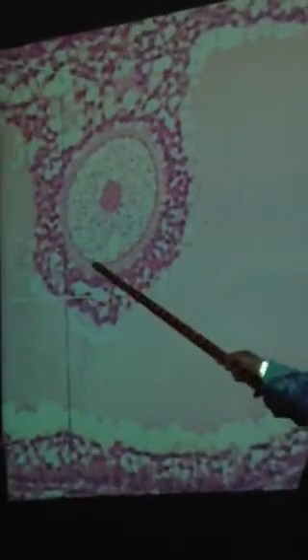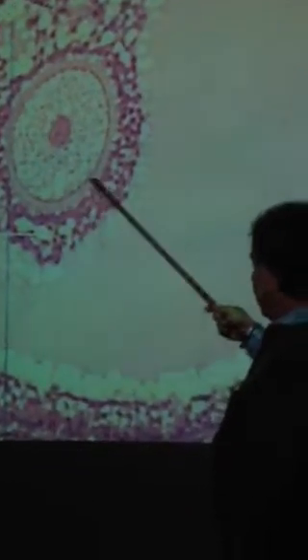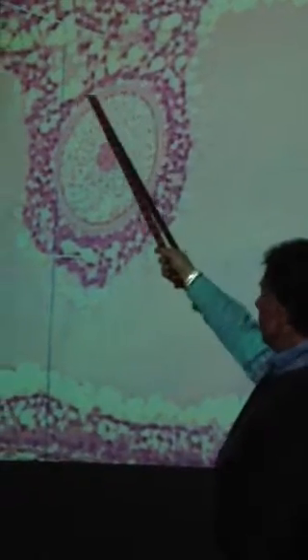All right, what are we looking at here? This is a follicle. It's got a large antrum. See the antrum, right? It's got the ovum, and then what's this area around it called? Anybody, real quick. Got to go through this quickly. Zona pellucida, and then what are these? Corona radiata, and what's the fluid inside here called? Antral fluid or liquor folliculi.